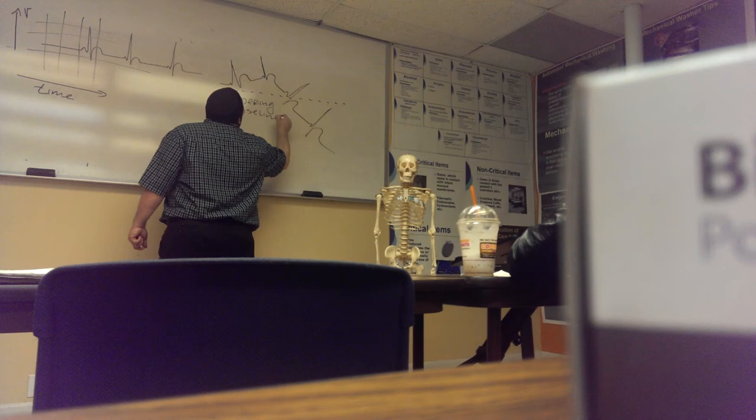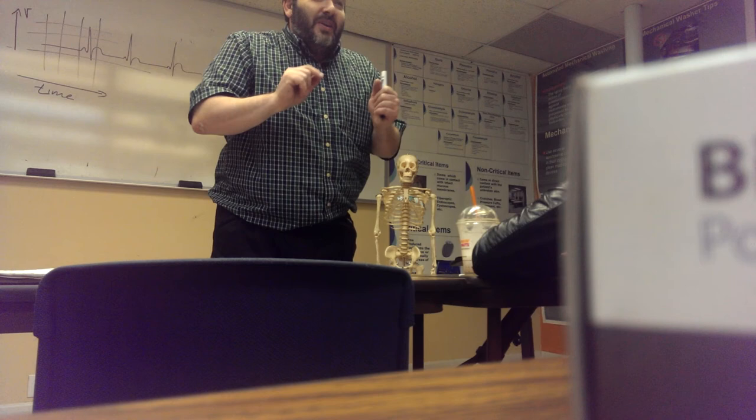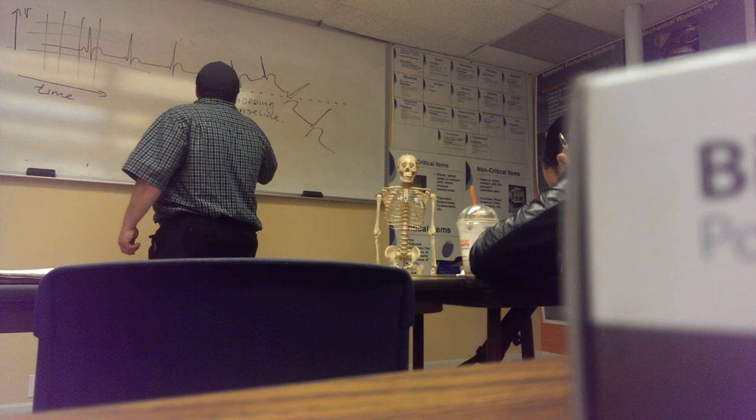Wandering baseline. Do not hand an EKG to the doctor with a wandering baseline because you can fix it. It's not a patient's problem. It's your problem. You screwed this up. May not be your fault, but it's something you can fix. And you know what brings on a wandering baseline? It actually looks like that on a piece of paper.